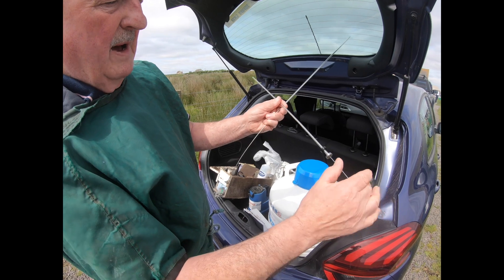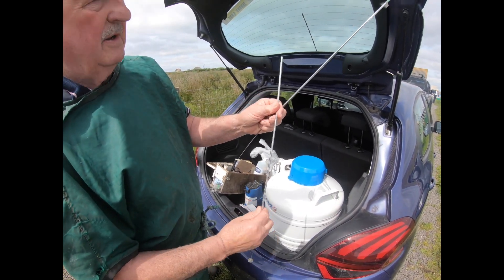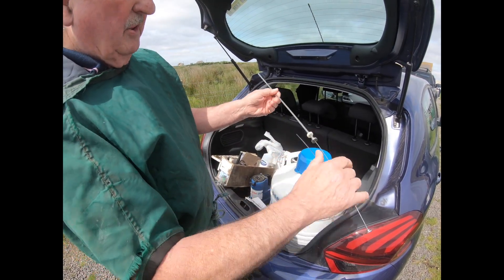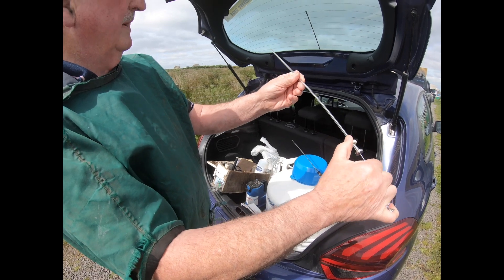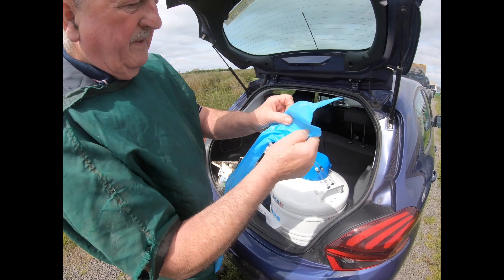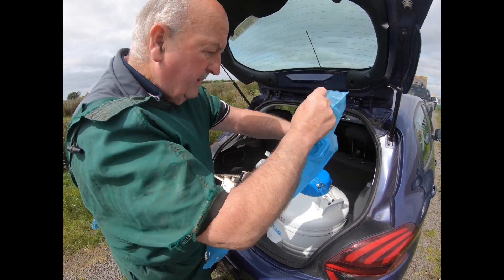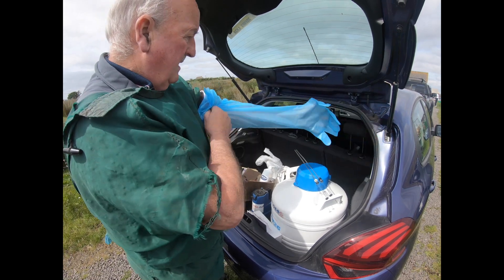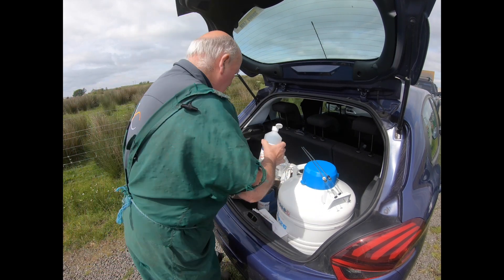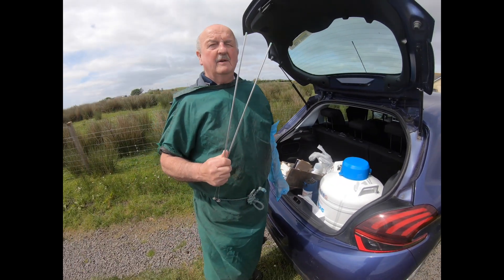This is the apparatus here, and that'll push the sperm into the heifer. So there it is, all loaded up and ready. I'll just take a glove and put the glove on — it's all quite clean and covered up. And we shall get a little lubrication here to go in the back passage of the cow, and we will go and inseminate the heifer.